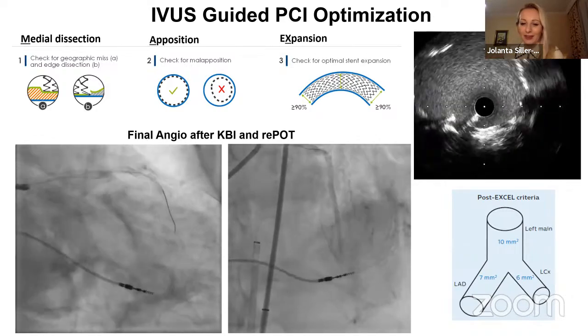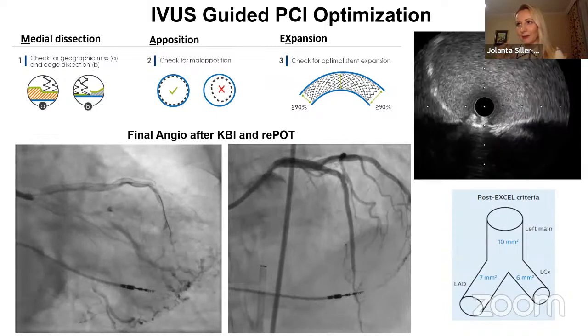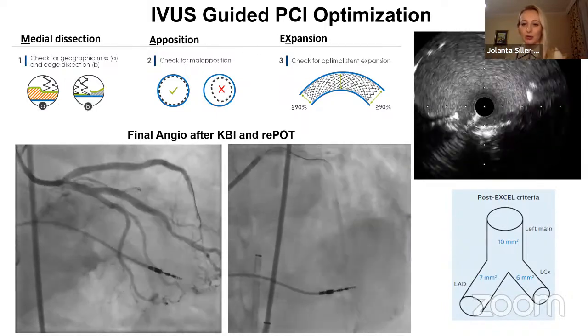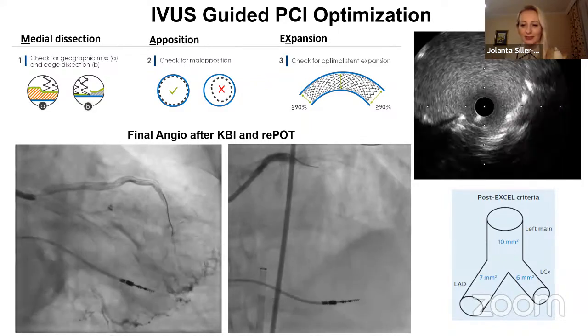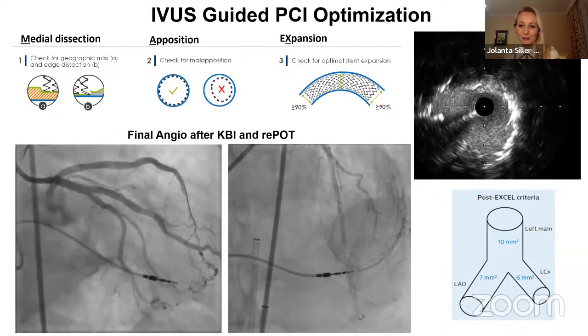So in your opinion, is it always important to do the post PCI imaging, or do you know also cases from your clinical practice where the final step was not possible?